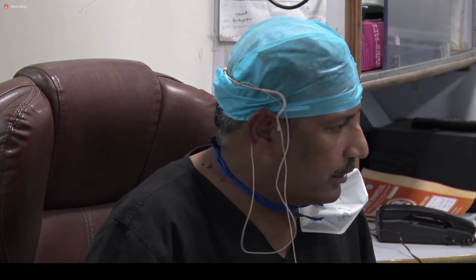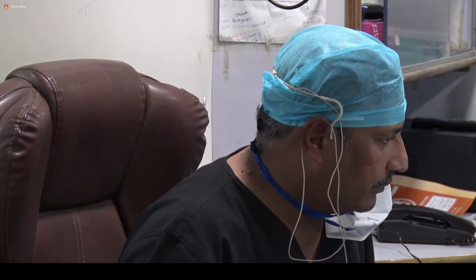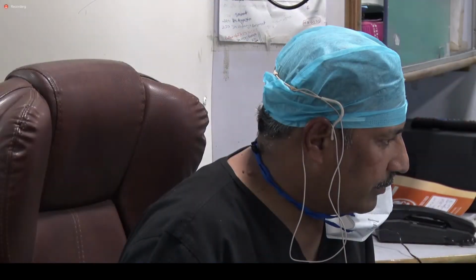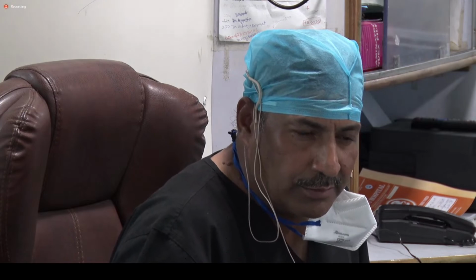Good morning. Kushal Majumdar. Sir, I have seen you are brave enough to go on the lateral side far away. What is the limit to avoid the stenosis of the eustachian tube area? Chances of failure of the eustachian tube. I have seen you are brave enough to go far laterally.